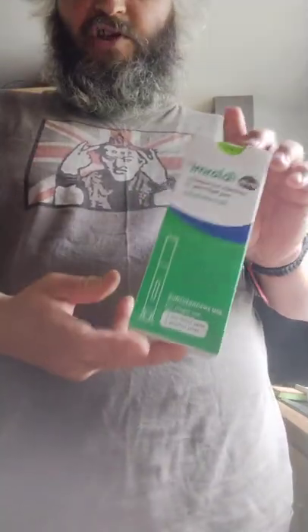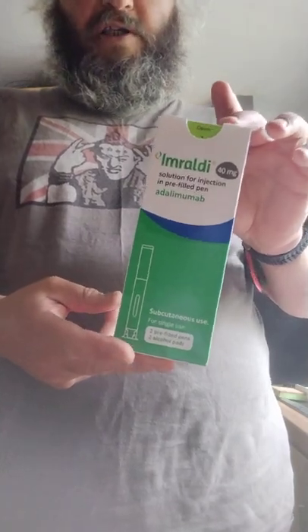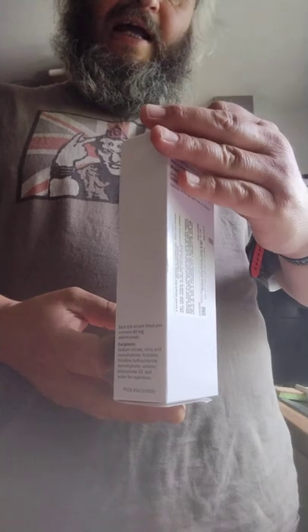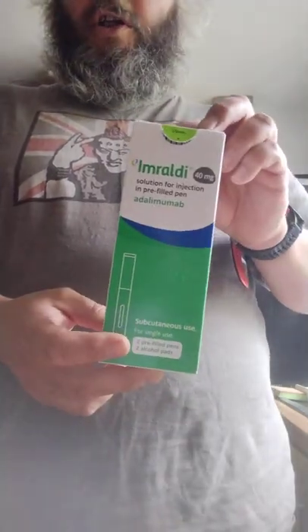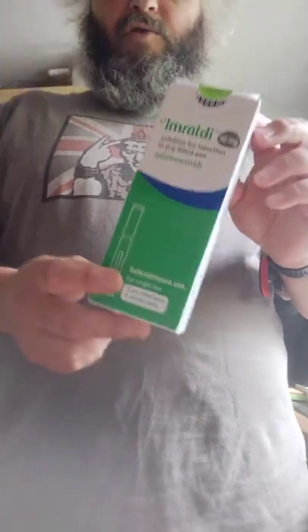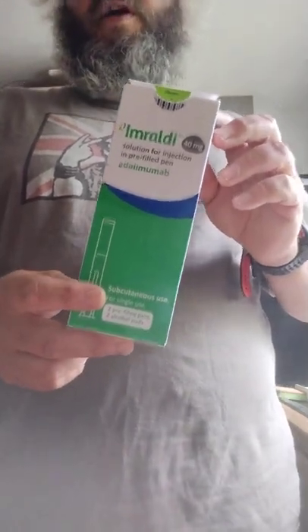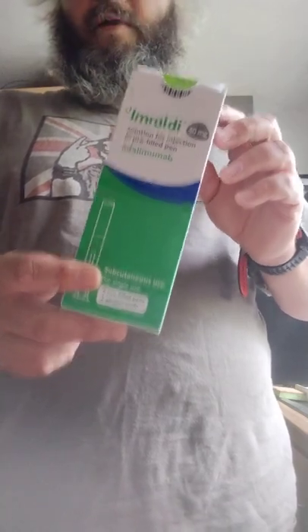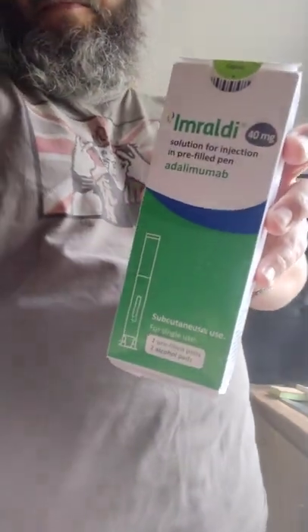Until another two weeks' time when we repeat the process. So there we are — an adalimumab injection, also known as Imraldi or Humira, used for loads of different things. It's an immunosuppressant, so fingers crossed I'll get COVID — there we go, happy days.